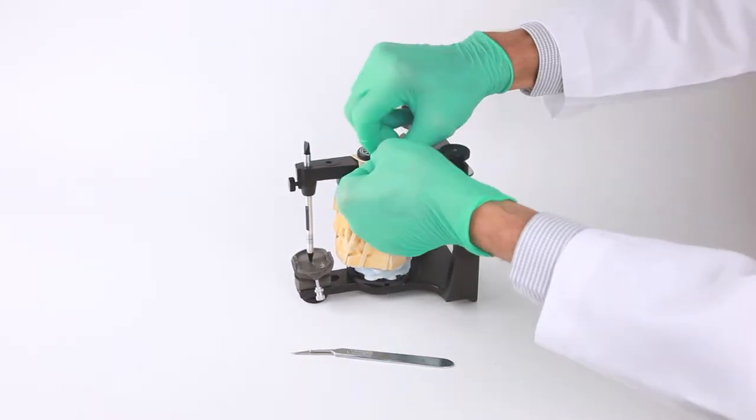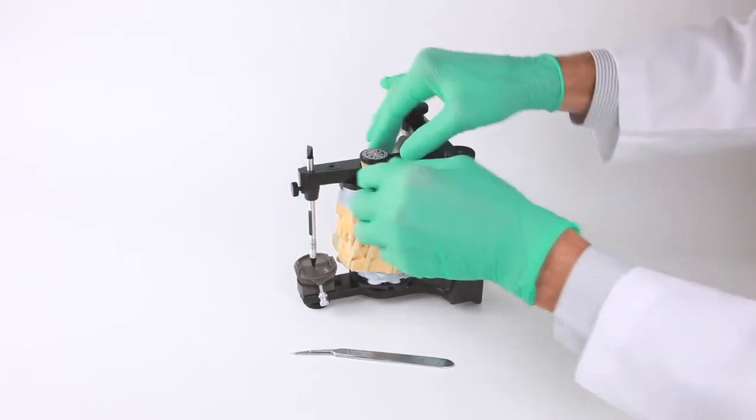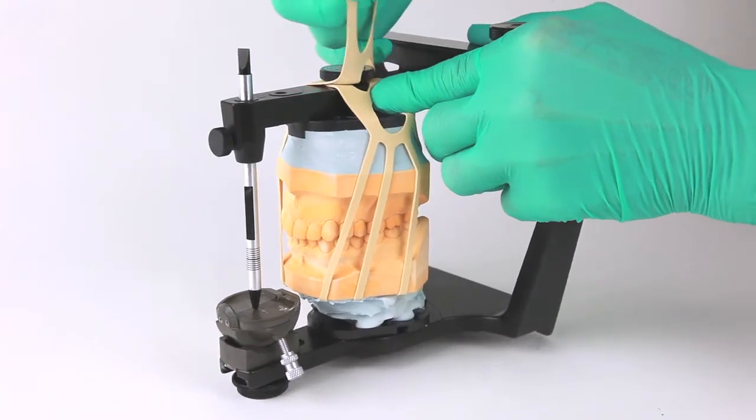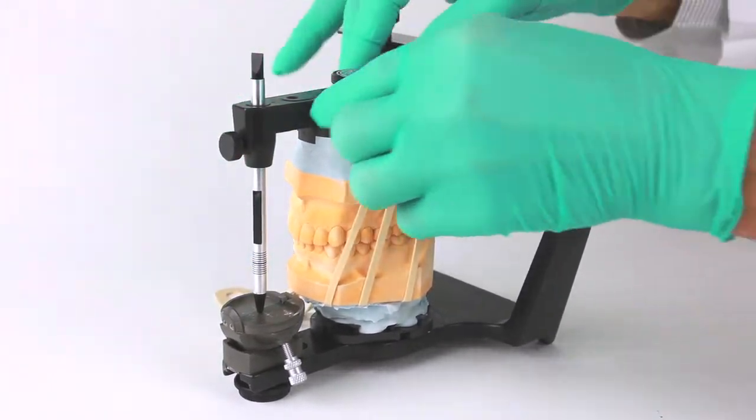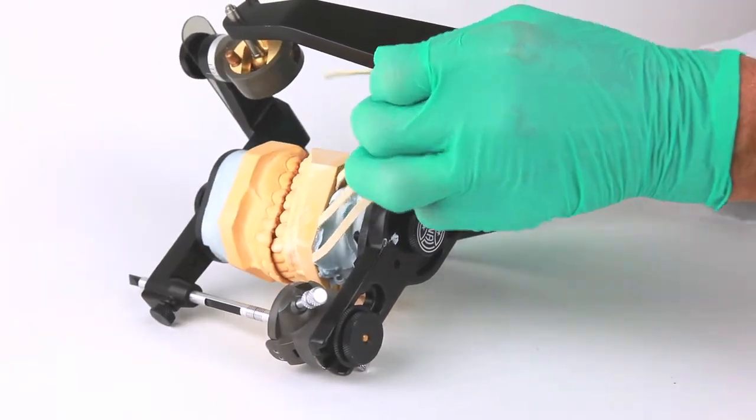After the stone has adequately set, the flexi-mount can be removed from the mounting thumbscrew on the articulator arm. Caution should be used not to put excessive force on the cast at this point. A second layer of stone should be added to give adequate strength to the cast mounting.